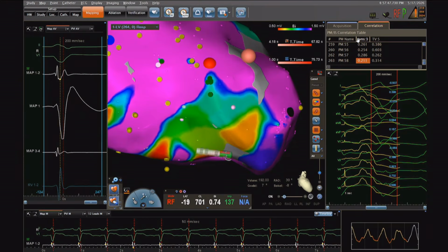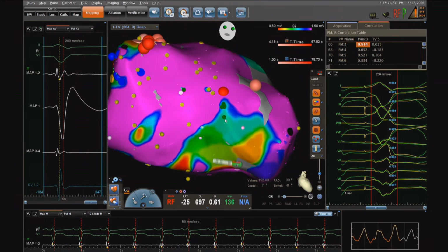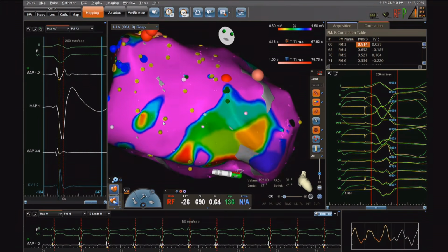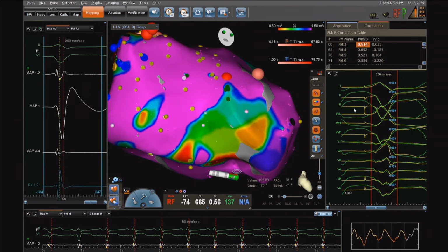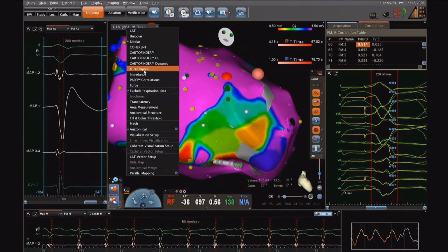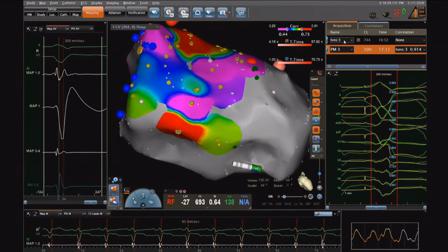And yeah, now we will continue to modify this area to do core isolation. And maybe tomorrow we will tell you how it ended. But the inducibility here is very problematic, so we can't rely on that. You see there is a point here with a correlation of 91%.